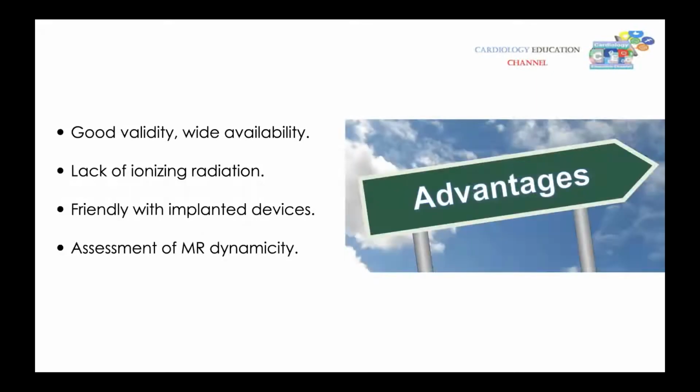There are some advantages of using dobutamine stress echocardiography, like its good validity and wide availability. There is a lack of ionizing radiation, it's not like using SPECT or nuclear scanning. It's friendly with implanted devices, so it's not like the MRI. It helps with the assessment of MR dynamicity, which is very important as well.